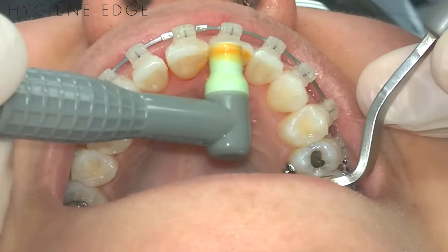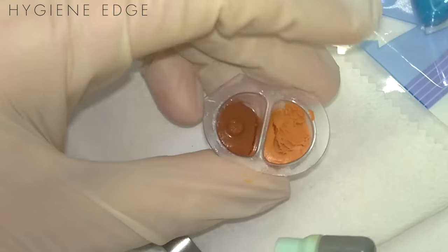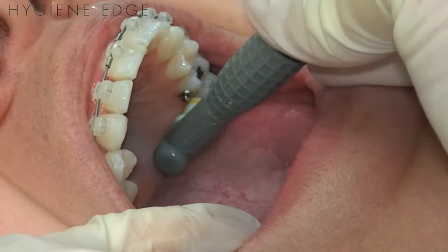If you have an area like shown here where you have heavy stain, you can use the coarse. Then on the posterior teeth here where this patient doesn't have hardly any stain, I could use the fine.